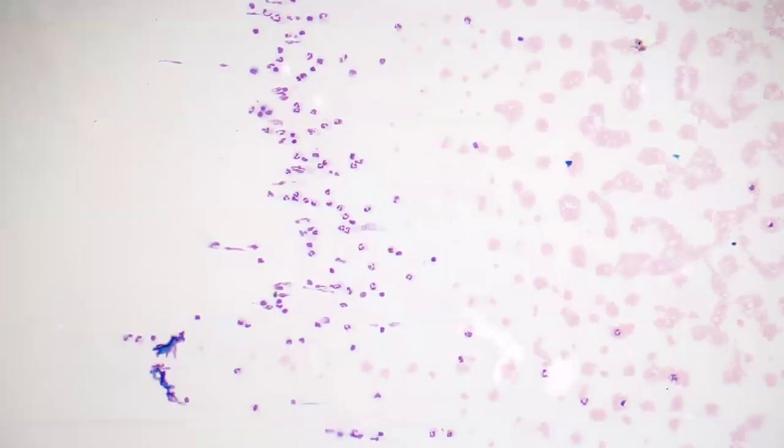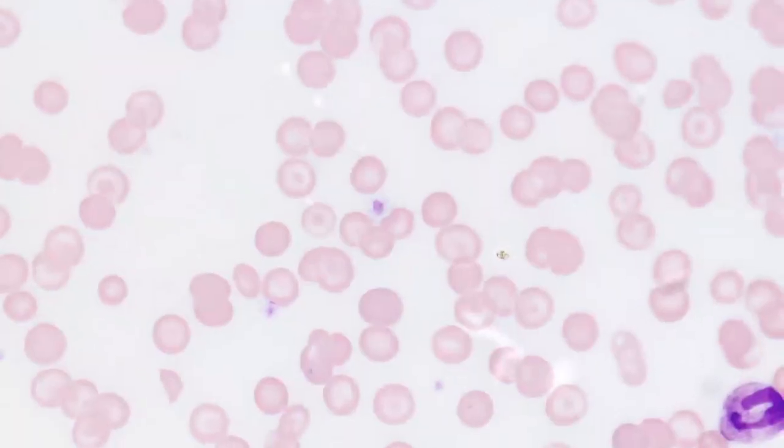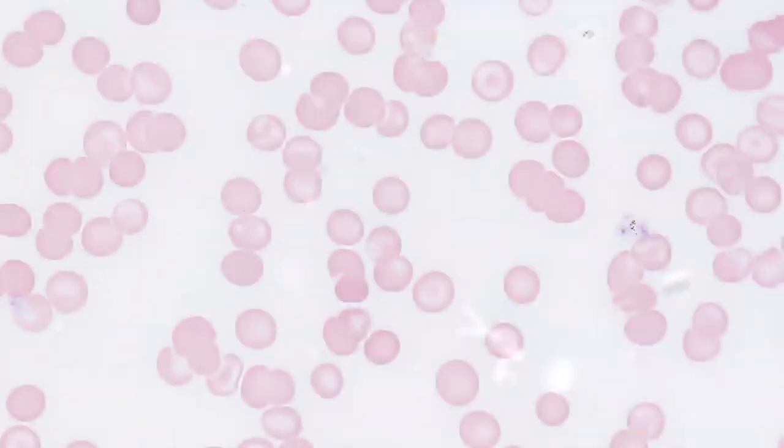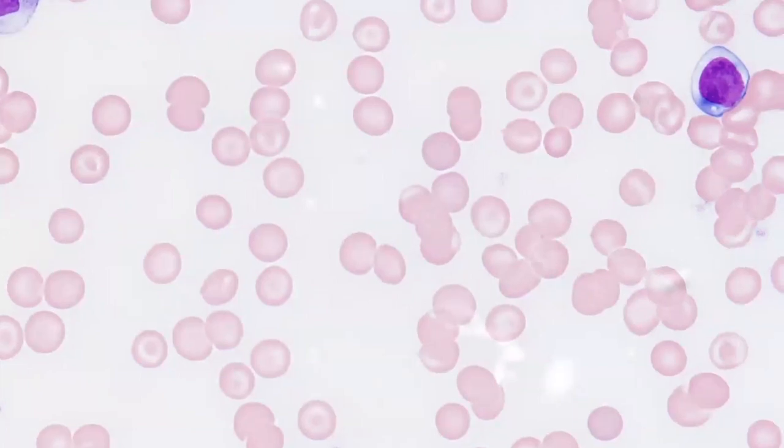Next, we'll see an example of codocytes, or target-shaped red cells. So here at high power, we can see many of the red cells show target-shaped morphology. In this example, the codocytes are due to liver disease. However, target cells are created when there's increased surface membrane to volume ratio.